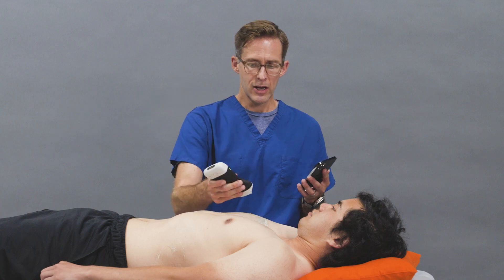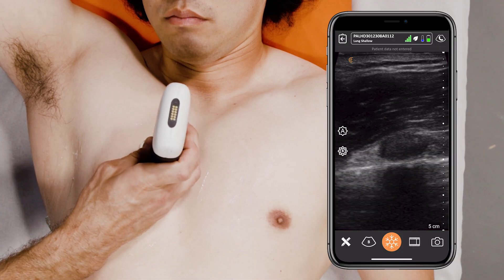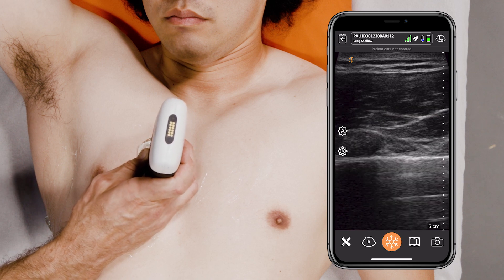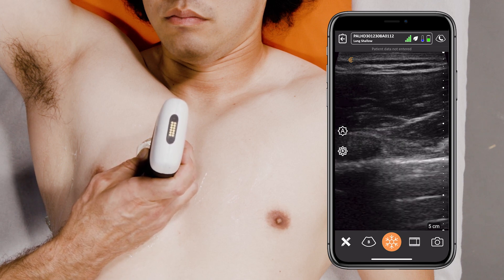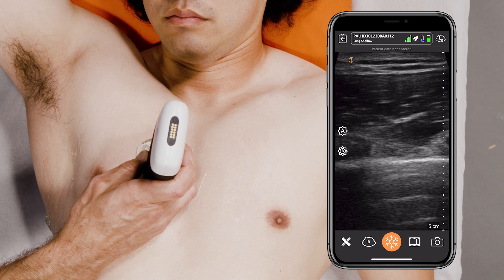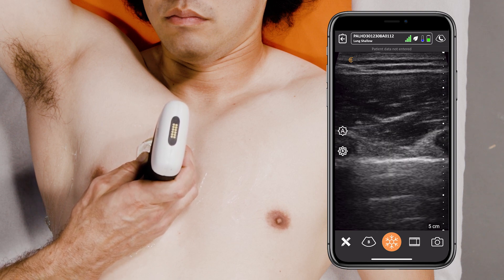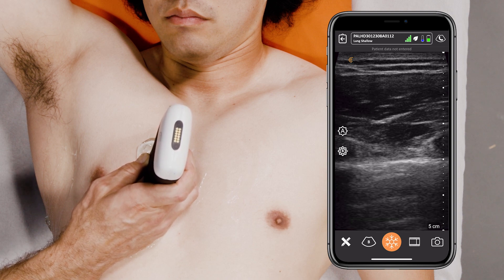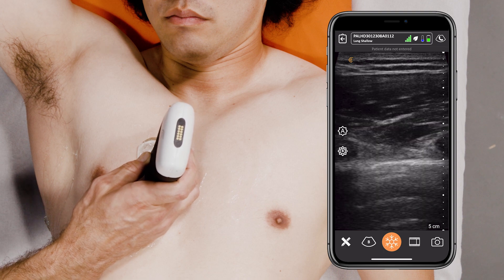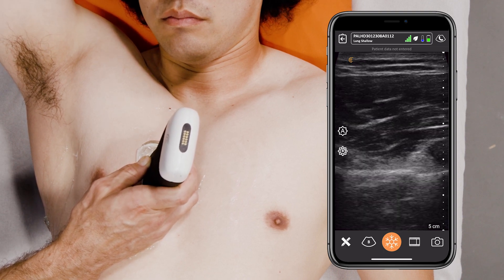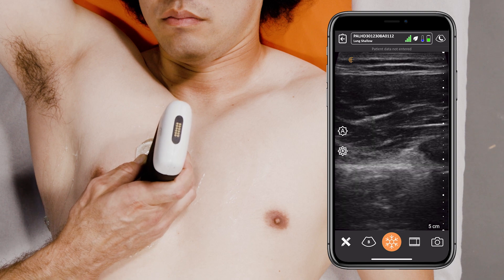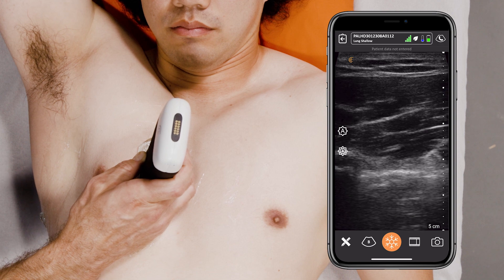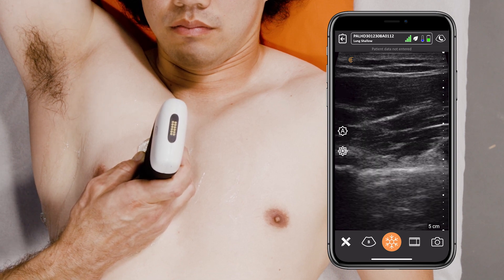Take your probe and put it over the anterior chest. This is one of those where you just sit there and watch. What you're seeing is a rib and then below that, visceral and parietal pleural apposition — you're seeing good lung sliding. Some call it twinkling, you can also see small comet tails sometimes, or call it ants marching. But what we're seeing is good lung sliding.